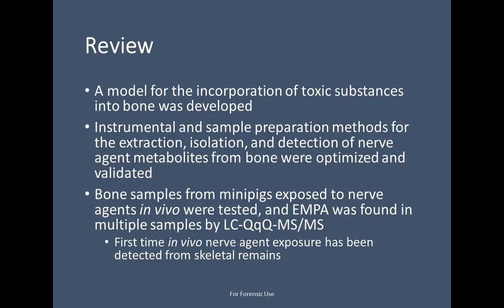So as a review, we developed a model to understand incorporation of toxic substances into bone. We developed an instrument method and sample preparation methods to go along with that. A lot of validation went into this, and you can, again, review that article in Forensic Toxicology to get all the details that were involved.